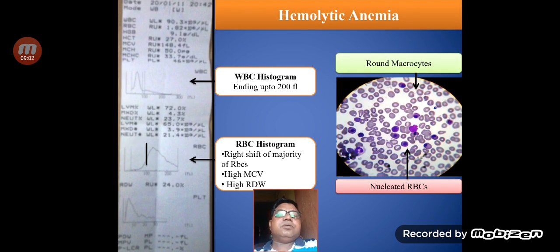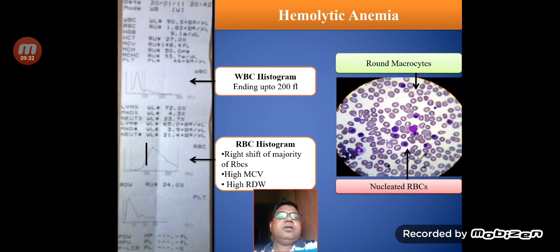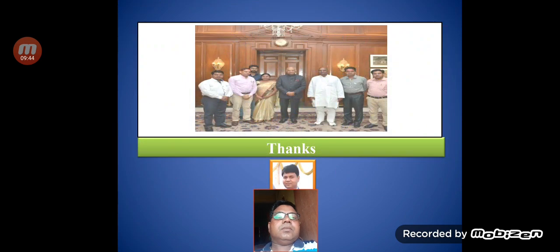In case number four, the WBC histogram ends just before 200 femtolitres, meaning there is no hypersegmentation. The RBC histogram shows a right shift of the curve with MCV very high at 148.4 femtolitres and RDW around 24.0%. On the peripheral smear of this patient, we see round macrocytes along with plenty of nucleated RBCs — consistent with hemolytic anemia. These cases demonstrate how we can appreciate the histogram changes to differentiate megaloblastic anemia from hemolytic anemia.